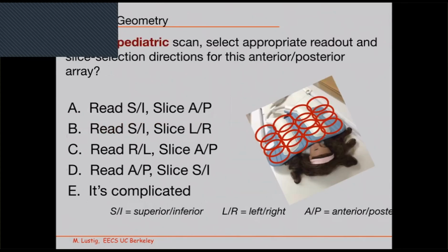Okay, for a pediatric 3D acquisition, select the appropriate readout and slice selection direction for this anterior posterior coil. There's a reason, yeah. What do you think?